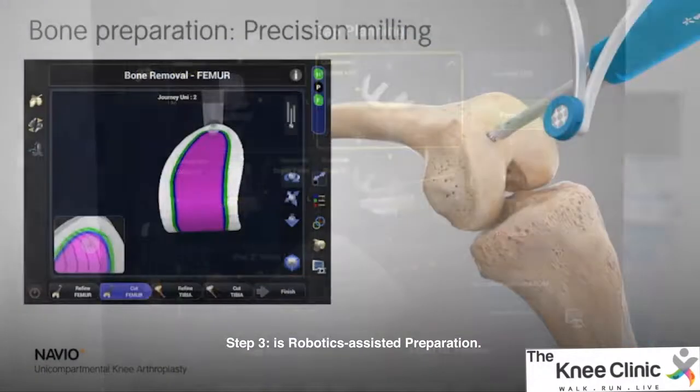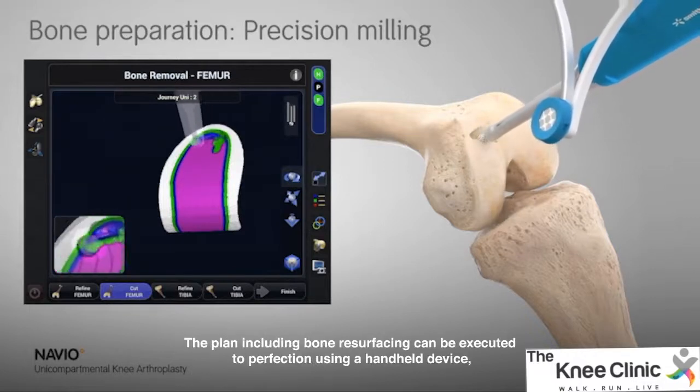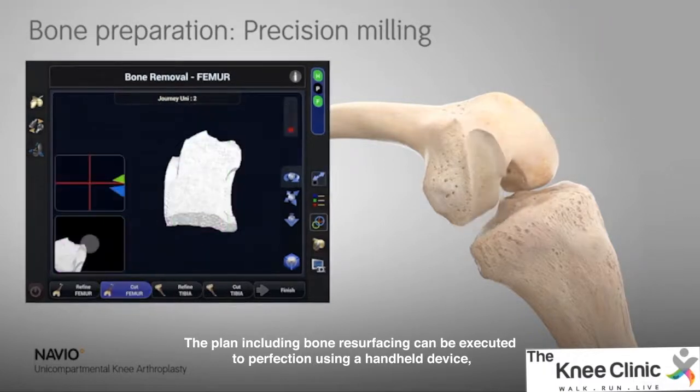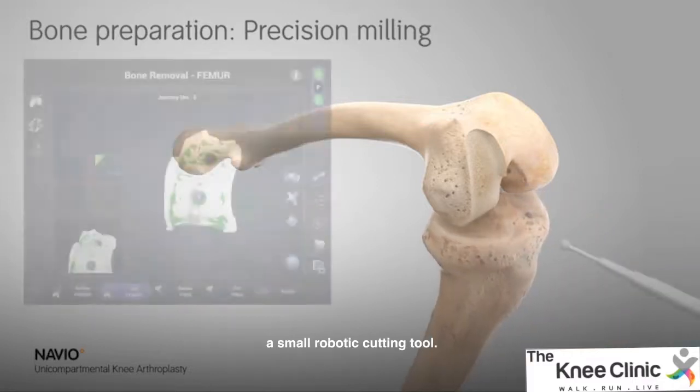Step 3 is robotics-assisted preparation. The plan, including bone resurfacing, can be executed to perfection using a handheld device, a small cutting tool.